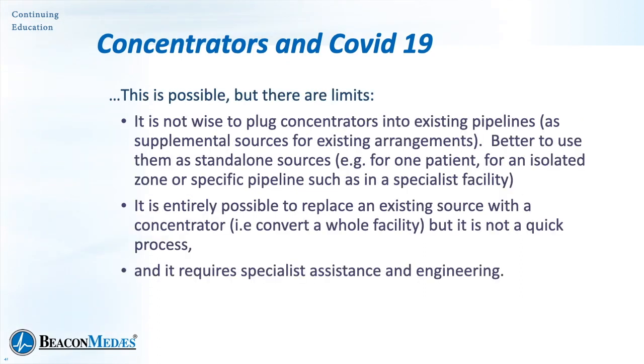This is quite possible, but we do need to keep in mind we don't want to take a concentrator and plug it into an existing pipeline. For instance, one of those portable concentrators could produce 50 psi oxygen. We could plug that into the wall and try and supplement the amount of oxygen that we have in our pipeline. Not a good idea.